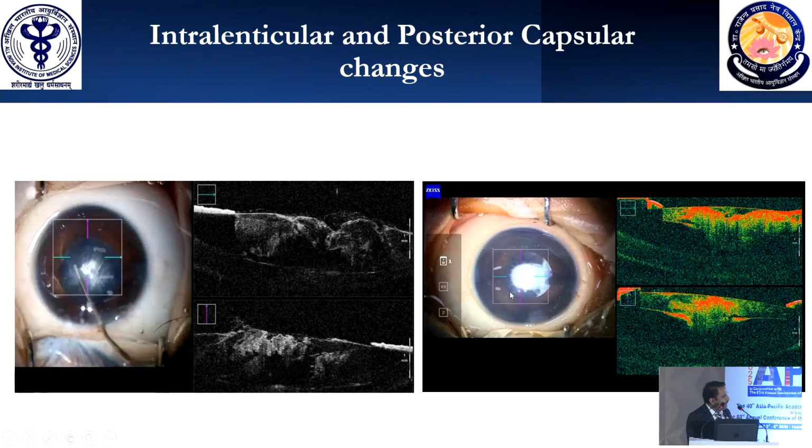And this is the second detail. That was anterocapsular changes on iOCT. These are micro details, and this is the intralenticular and the postcapsular changes. So here the surgeon is doing the hydrodissection. Of course, Professor Coker is the surgeon here. And once you do the hydrodissection, see how the lens material is behaving. In some cases, some membranous cataract, the material won't dissect out. So in those cases, probably you need to use phacoaspiration. So those are the indications which you can understand.